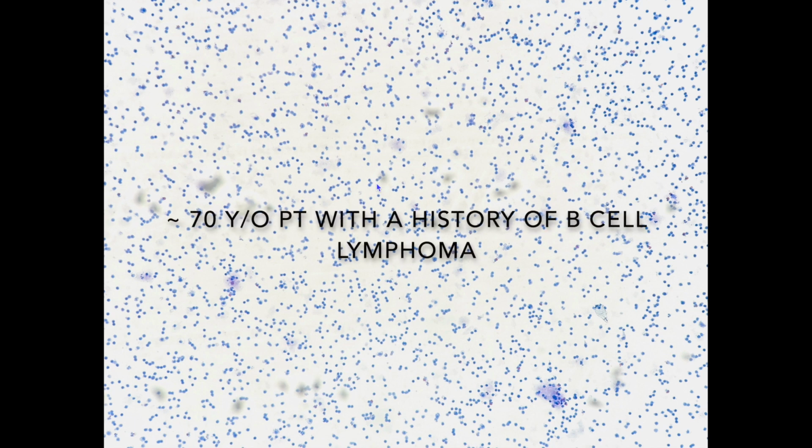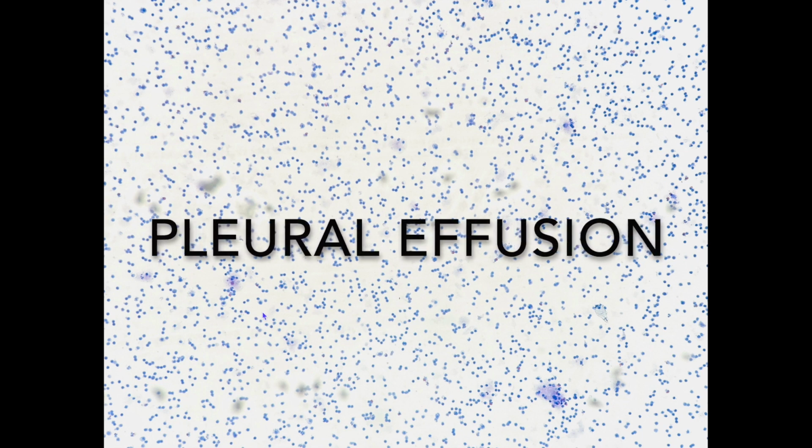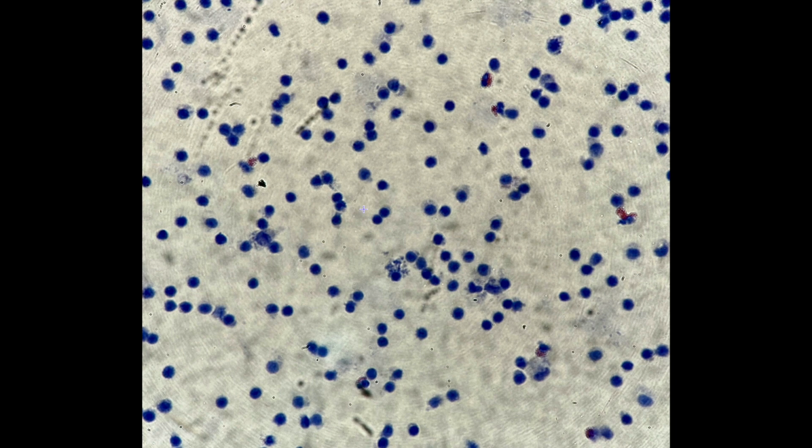Here is a 70-something-year-old patient with a history of some sort of B-cell lymphoma, who had pleural effusions. From here, we see a scattering of very small cells with some histiocytes that I could appreciate on low power. But these cells, I'm not sure if they're red blood cells or lymphocytes. So closer up, we see hyperchromatic cells that are fairly uniform with this thin rim of cytoplasm, more consistent with lymphocytes as opposed to red blood cells. And then you have some eosinophils as well as your macrophage.